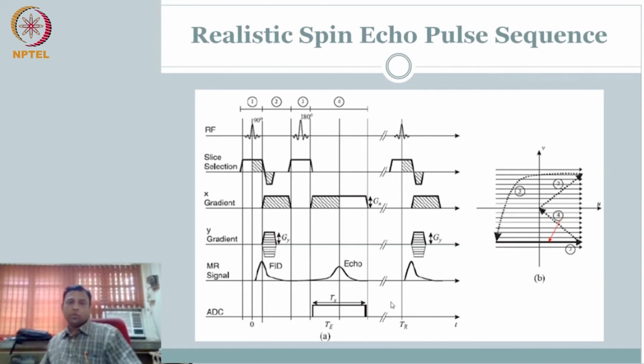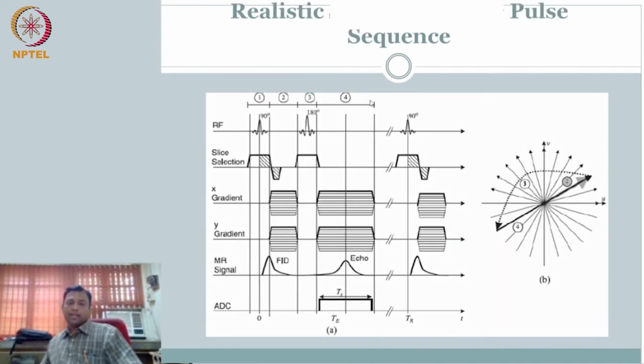Okay, so now last but not the least, can you again do the same exercise? This should be fairly straightforward, right? Oh, I see this. I should perhaps not have shown this. Maybe that will be the task in the exam or homework. So the idea is, look at the sequence. Can you guess the path? I have an RF pulse, but I am applying X and Y simultaneously along with slice selection.